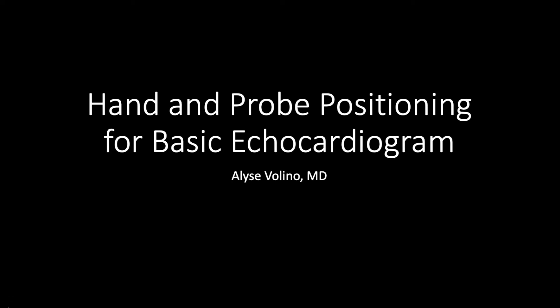Hi everyone, this is Elise Villino. In this video, we're going to be discussing hand and probe positioning for basic views in an echocardiogram.